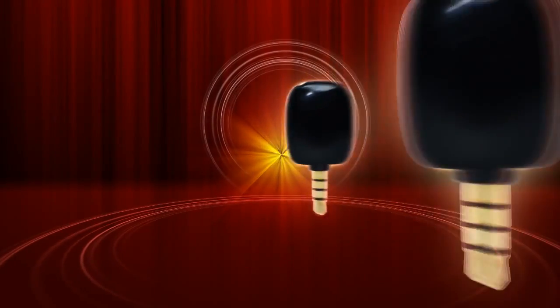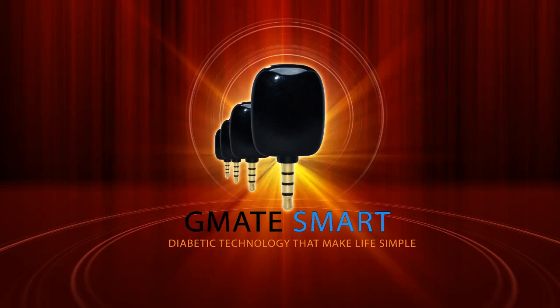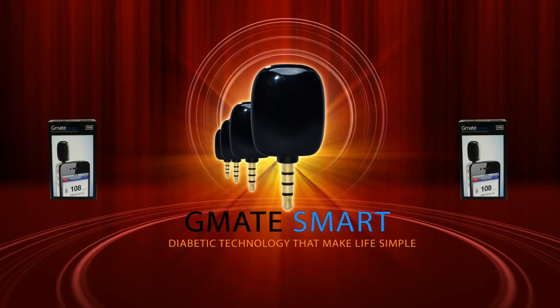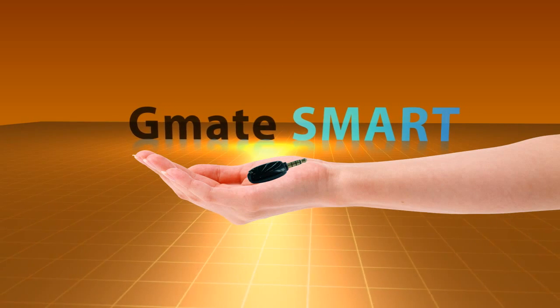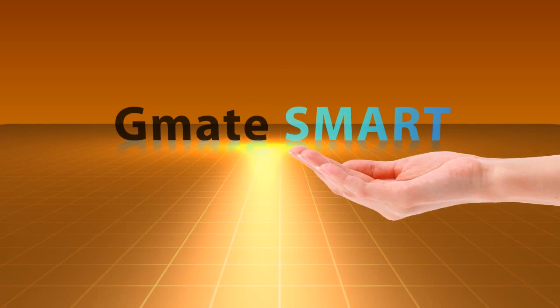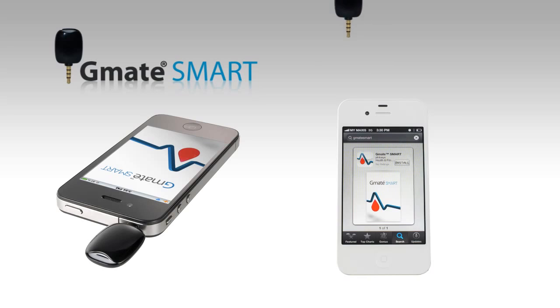The G-Mate Smart Glucose Meter is the only true smartphone glucose meter to connect directly to the iPhone without the need of a costly adapter. The first in its class and weighing in at less than 2 ounces, the G-Mate Smart is the smallest, most innovative blood glucose meter in the world. The G-Mate Smart connects directly to the headphone jack on the iPhone — the only device to utilize the headphone jack as both a power source and data connection point.